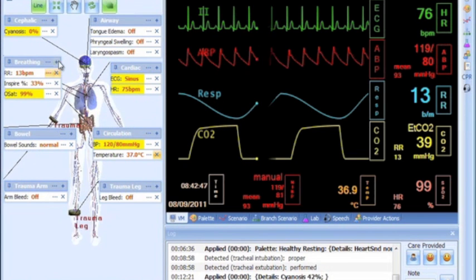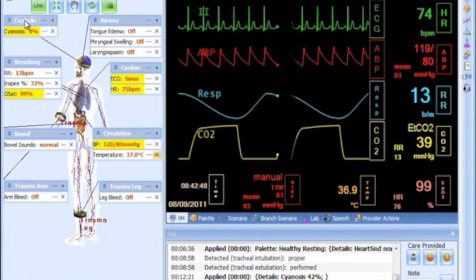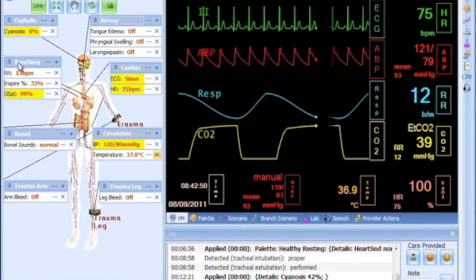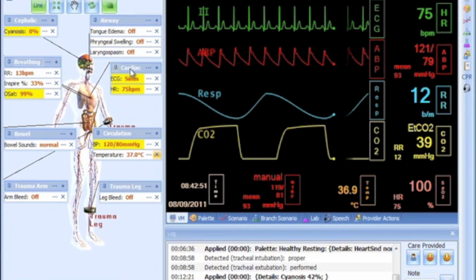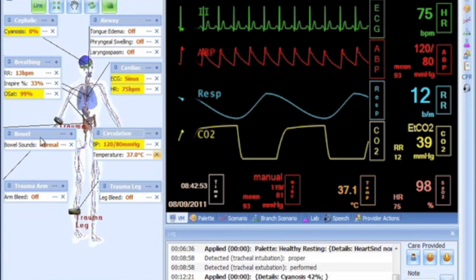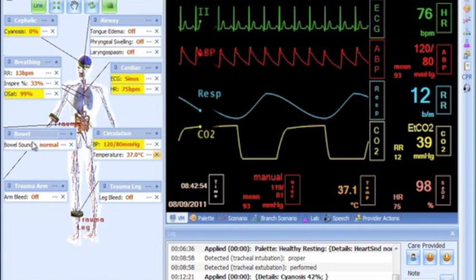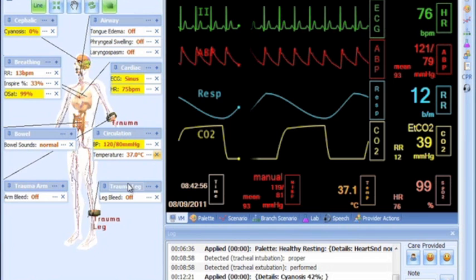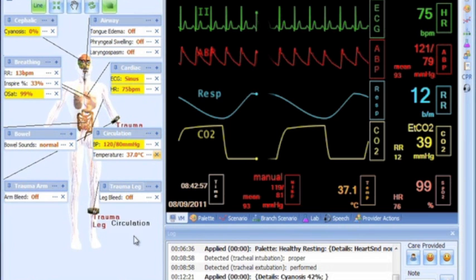HAL's 3D model has been subdivided into different regions. These regions are cephalic, airway, breathing, cardiac, circulation, bowel, trauma arm, and trauma leg.